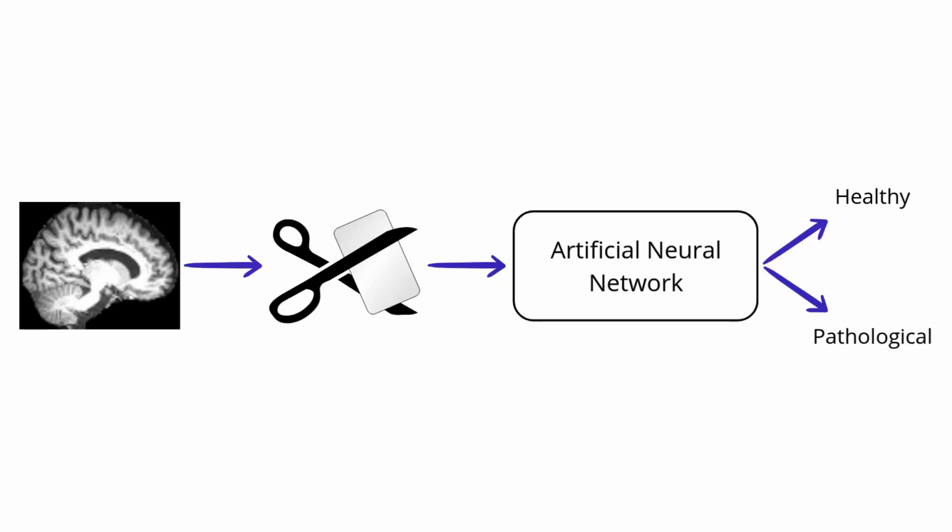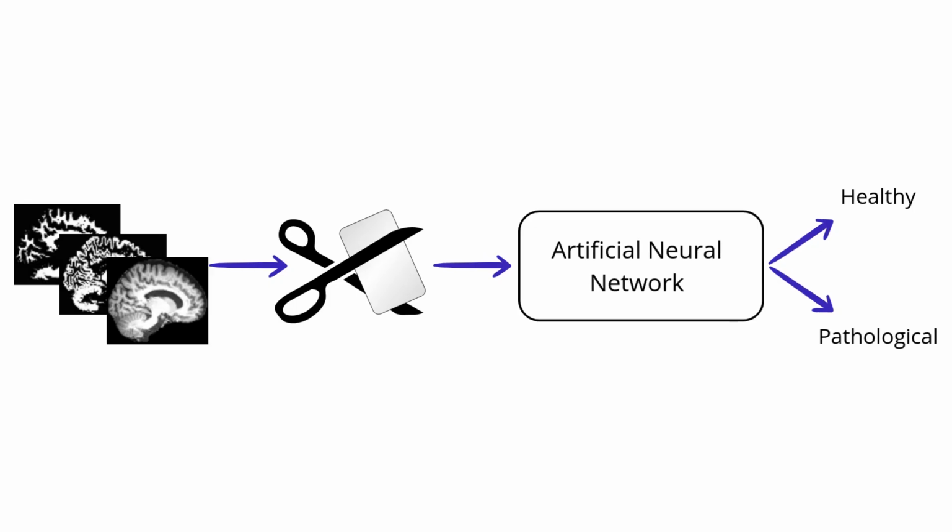We then evaluated the CNN's learning when faced with a single type of image or a combination of several types. This method allows us, depending on the type of map added, to have an indication of where the CNN will focus its searches.